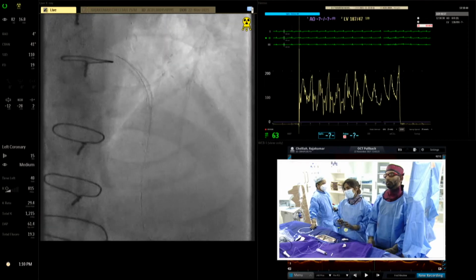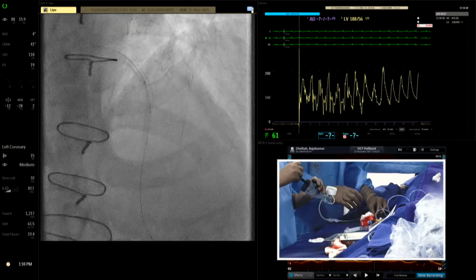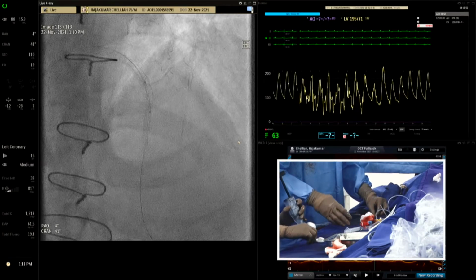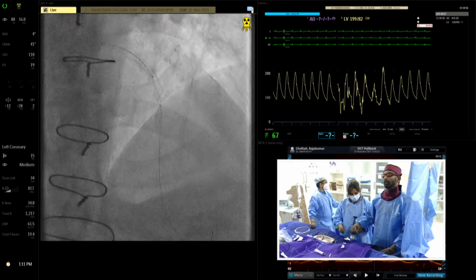Okay, same problem. Yeah, that's gone now. Yeah, okay, yes, so we need to remove the other wire. Why? Yeah, because we can't do both. Can pull the wire down. It's okay. Which one? Hold this. Yeah. This I'm pulling. And this needs to be pulled.